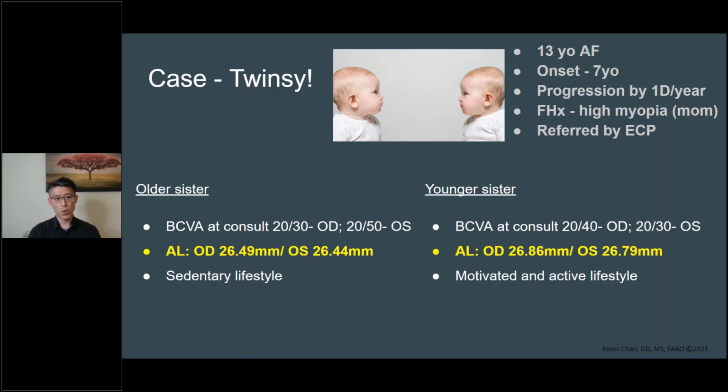Let's look at the older and younger siblings. I just want to highlight the fact that the axial length measurements actually look pretty comparable between these 2 siblings.